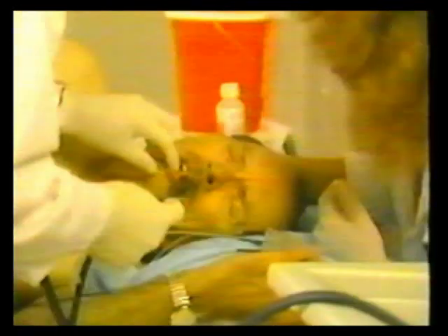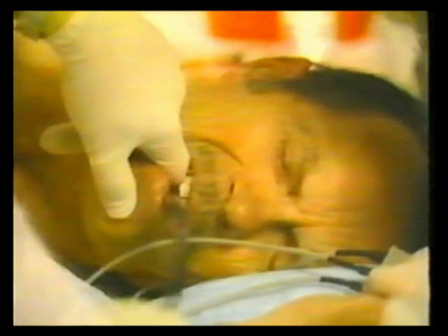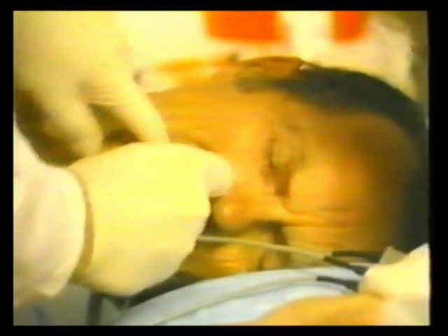The scope tip is lubricated with KY jelly. The technique illustrated in this examination is a digital entry technique. The left index finger is inserted to the back of the tongue. The scope is placed beneath the index finger and then forced downward, having the patient swallow once. The scope usually slips into the esophagus without appreciable resistance. A bite guard is then placed between the teeth to protect the electronics of the endoscope.